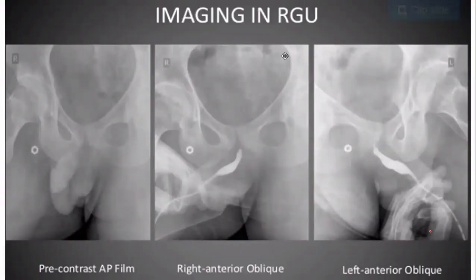So this is the penis of the patient. They're actually examining the posterior urethra of your patient here. Anyway, just for example, I would like to show you something. So this is the urinary bladder portion here.